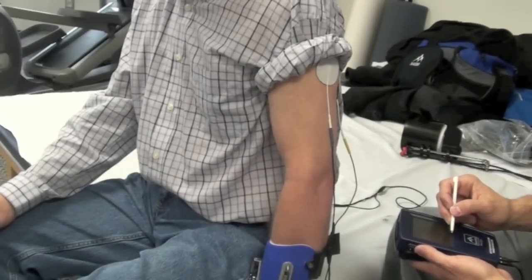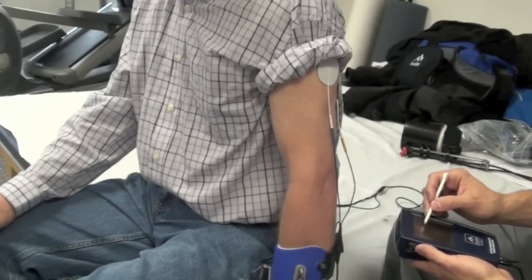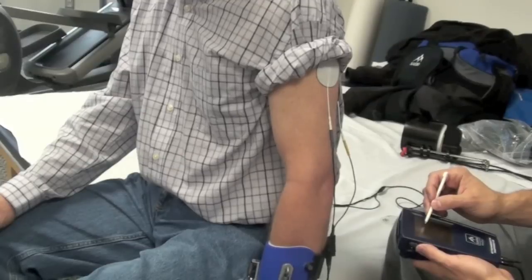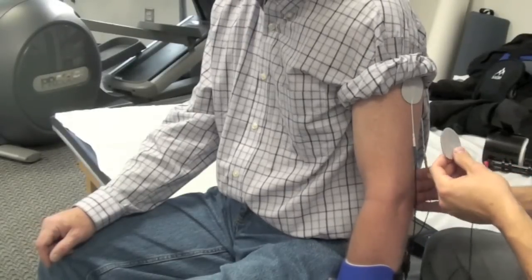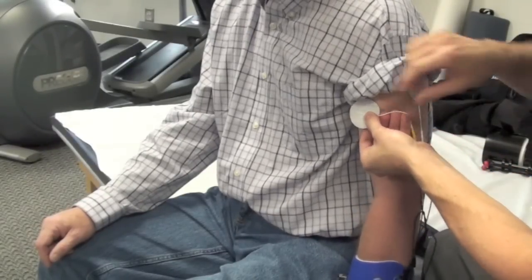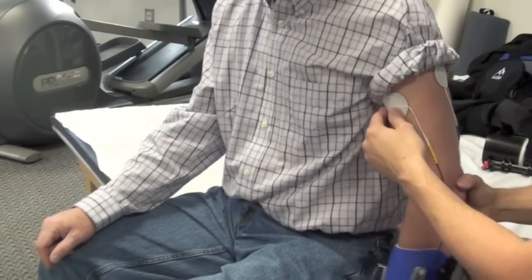Next, turn on the device and increase the current being delivered to the triceps until you reach a suitable contraction. Once you are pleased with the current being delivered to the tricep muscles, next we will focus on the biceps.